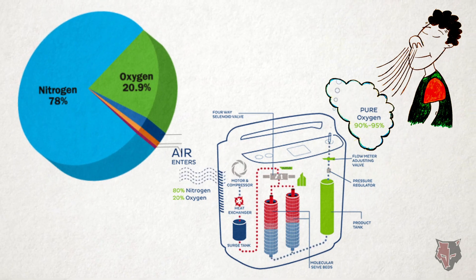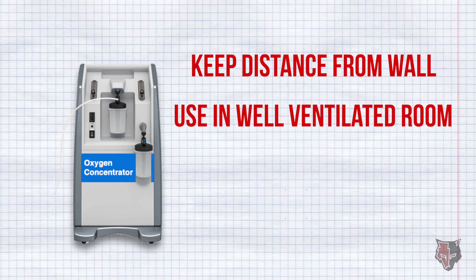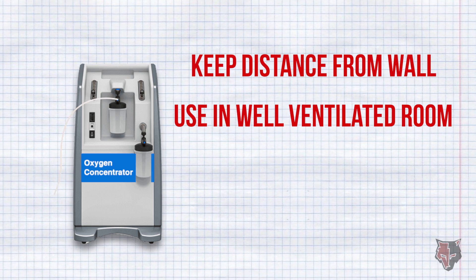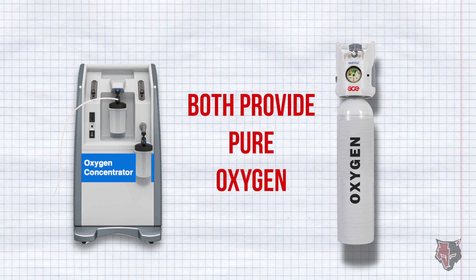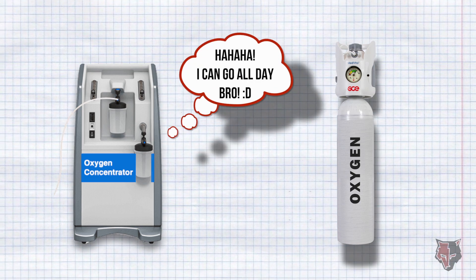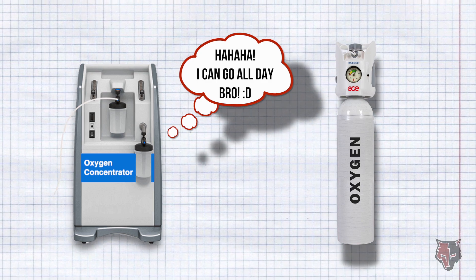An oxygen concentrator should always be kept away from the wall and used in a well-ventilated room with windows open, as the exhaust nitrogen needs to exit the room. Oxygen concentrators and oxygen cylinders serve the same purpose of providing pure oxygen. The main difference is that oxygen cylinders need refilling, while the oxygen concentrator does not need refilling and can provide oxygen 24x7 using electricity.